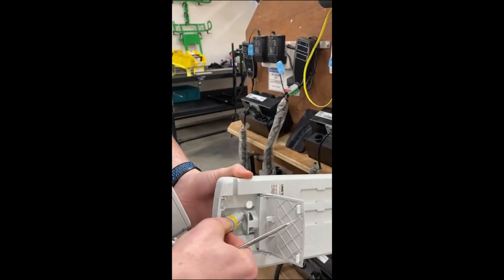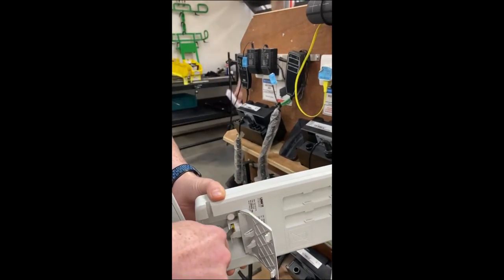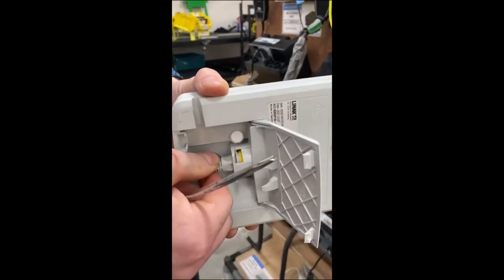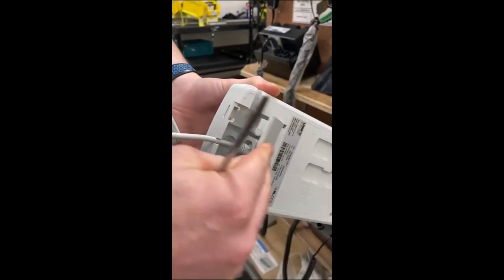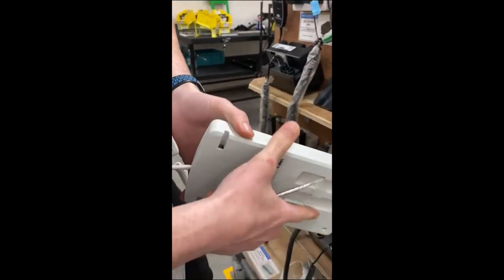Open that up, make sure that little arrow — kind of a clock face — is facing up, and then make sure that the yellow bit there is fully in like that. Clip it down in there, clip it back down like that.